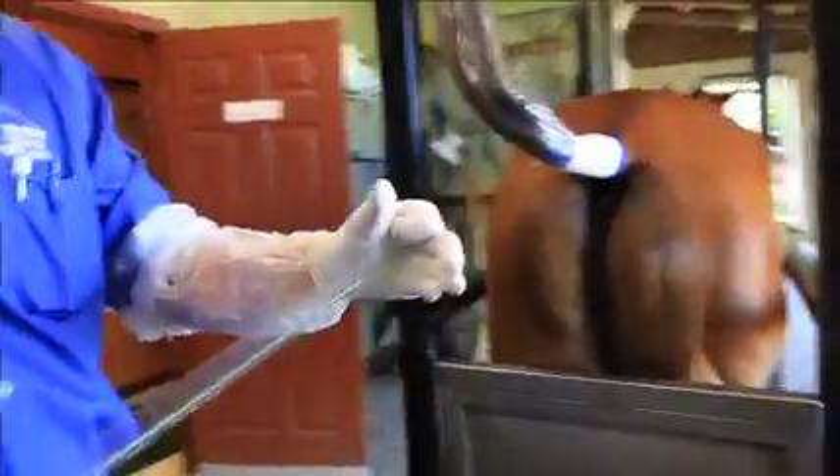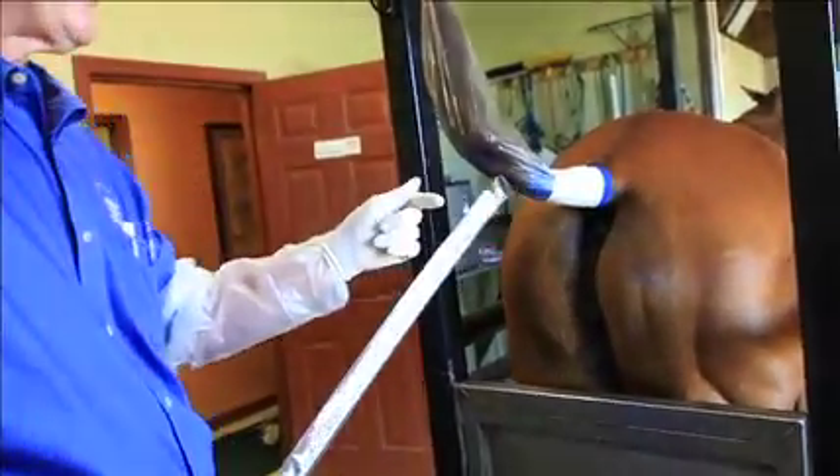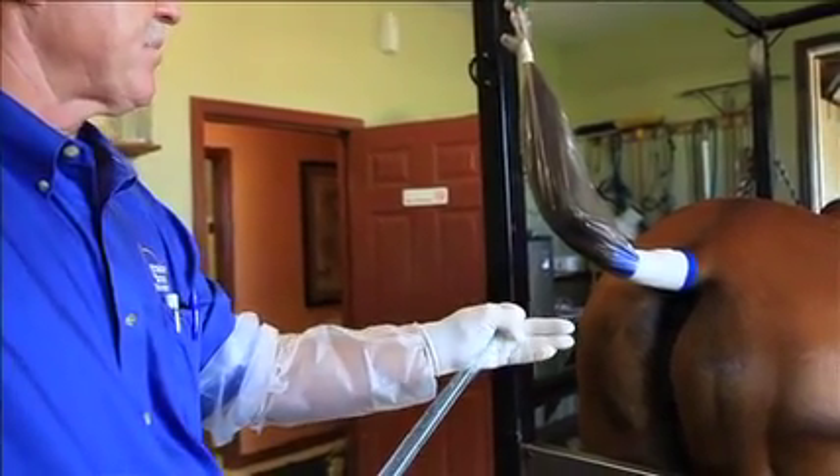Now I'm going to take this and protect the gun in the palm of my hand. My finger is what I'm going to touch her cervix with ultimately to introduce the gun, so I want that fingertip well protected. I'm going to go in the mare vaginally.